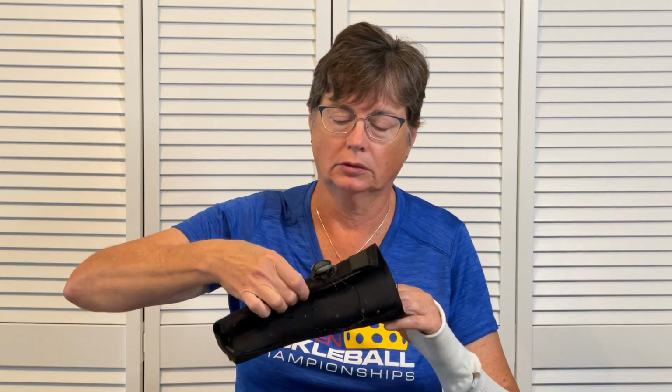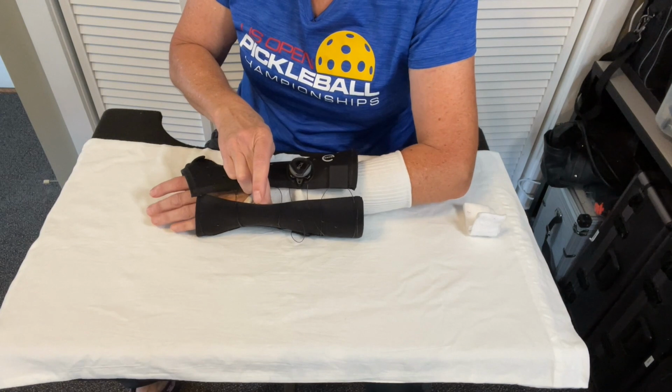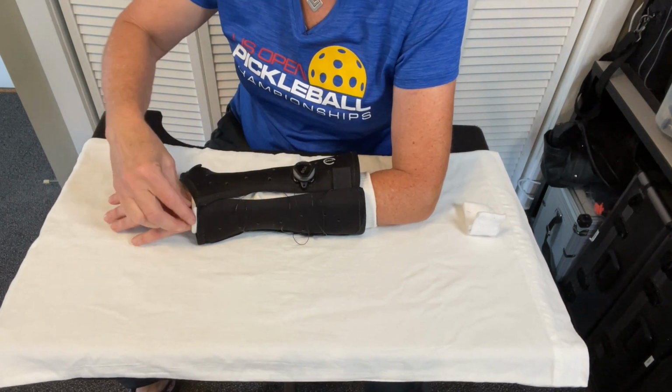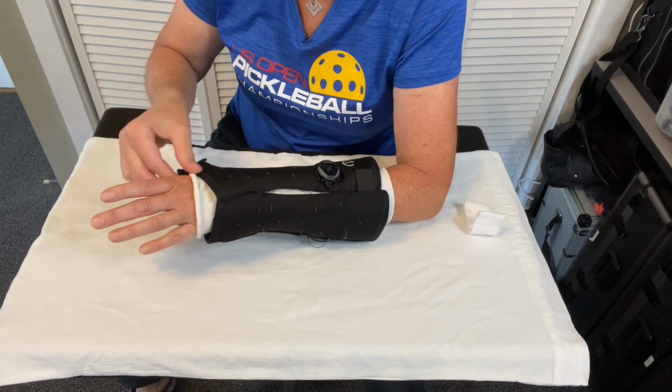So getting this back on, you kind of just reverse the order to spread it. Slide my hand back in. I have to retrieve some of the sock that rolled back. That's not too bad.